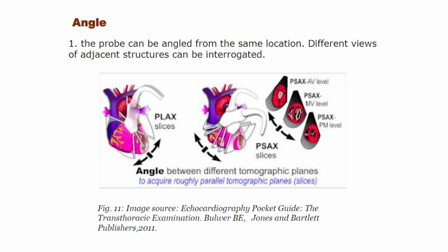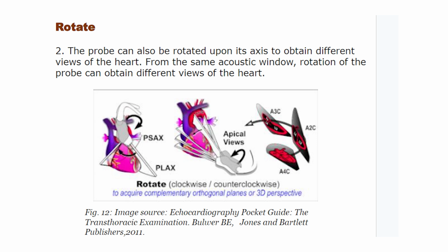Figure 8 shows commercially available linear, curvilinear and phased arrays. Figure 9 shows a linear phased array and illustrates how the ultrasonic beam can be focused in any desired direction by controlling the phase of applied voltage to individual elements. Figure 10 shows a conventional single transducer versus a phased array consisting of 16 transducers.